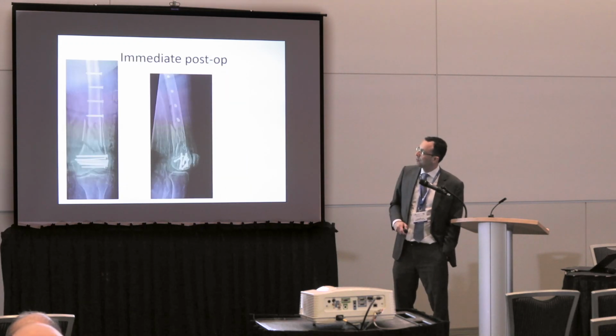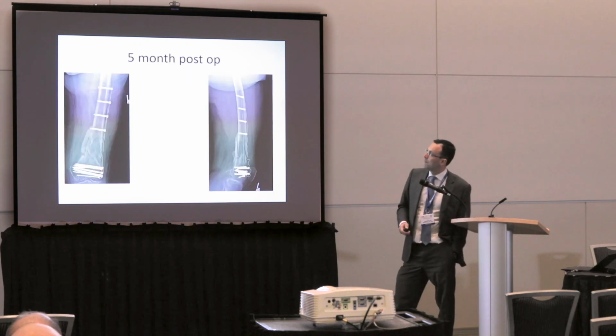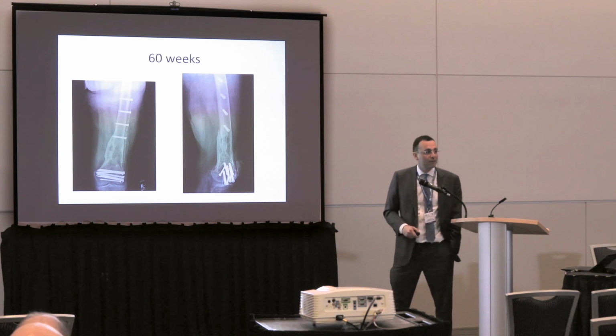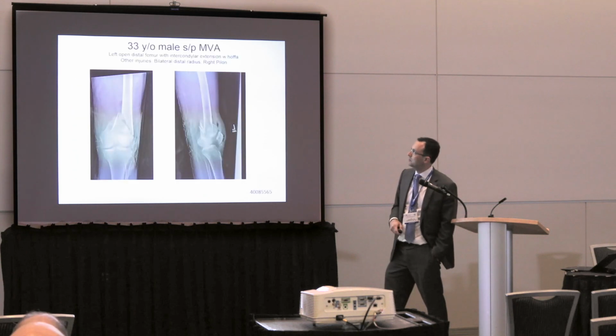And this is her immediate post-op. At 8 weeks, I began weight bearing on her. At 5 months, you can see it's consolidated really well. At 10 months, it's beautiful. And again, what I love is you can see right here, it's beautiful. And with her, I had a 60-week follow-up. And again, she's doing well. She's not had any complaints, and so on.